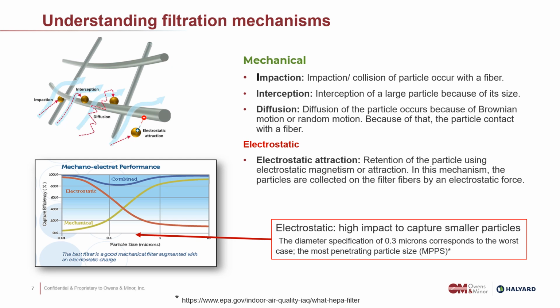But what happens with the particles that are smaller? And then here at that junction, you have the famous 0.3 micron, which is in the literature also called the most penetrating particle size, meaning that it's about the nastiest thing that you can find to penetrate a packaging.